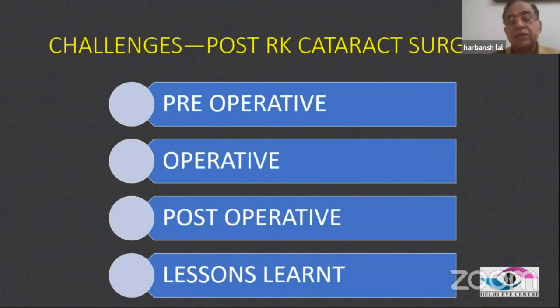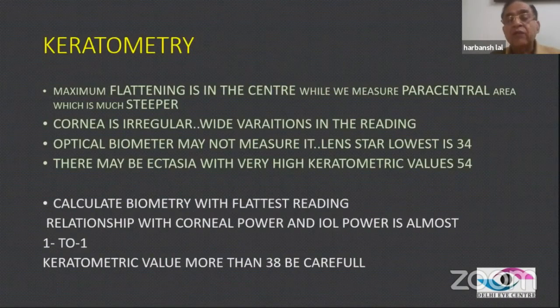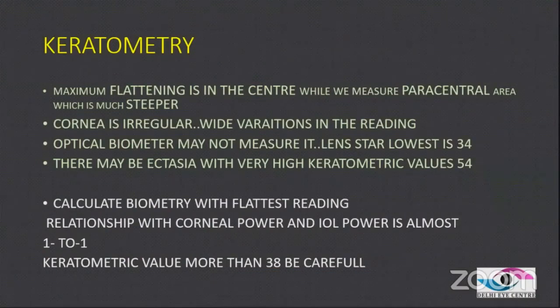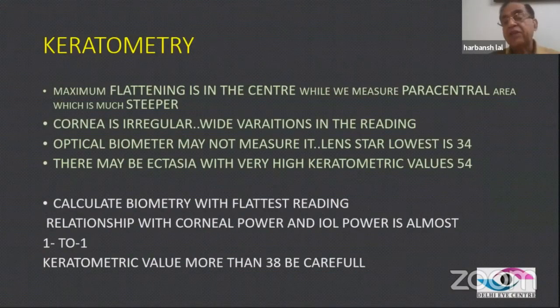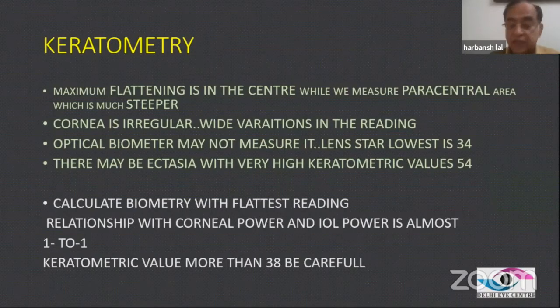The challenges when doing cataract surgeries are primarily preoperative, in the calculation of the biometry, then operative and post-operative. Preoperatively, the toughest part is getting the right keratometry and biometry. Maximum flattening is in the center, while most equipment measures the paracentral cornea, which is much steeper. The cornea is irregular with wide variation in the readings. The optical biometer's lowest keratometric reading is 34 diopters, maybe 32 or 30 diopters. And there may be ectasia with a very high keratometric value. So whenever we are doing the biometry, we need to take the flattest reading given by any of the equipment, and we need to understand that one diopter of error in the corneal power changes the IOL power by one diopter.